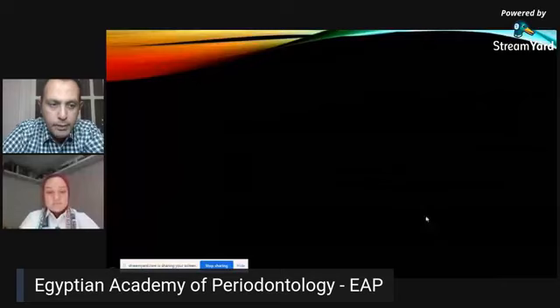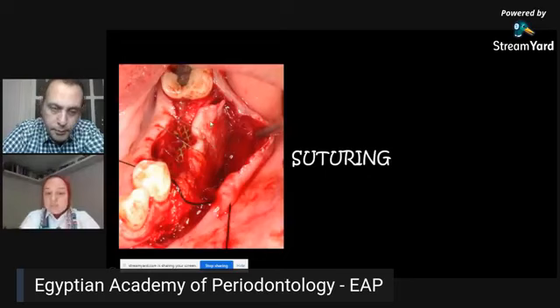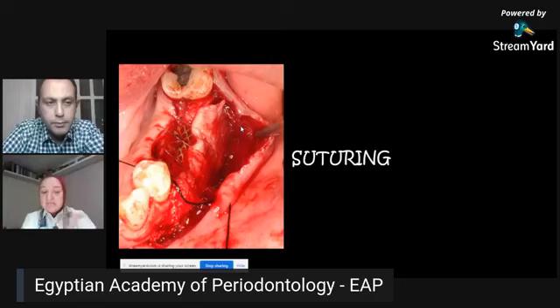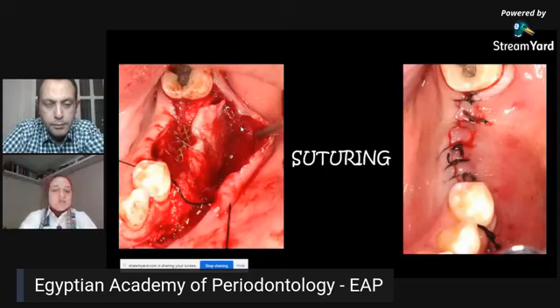Okay. So, as we said, we apply the titanium mesh and the graft material, and then we start suturing the inner layer alone. As you can see, the inner layer is still tough and tight because it's not separated from the periosteum. And this periosteum is the reason why you cannot achieve primary closure with this extension. Imagine if this flap was all one piece. You will never achieve primary closure without doing something with the periosteum. So instead of doing the normal scoring or the fenestration of the periosteum that we do with the periosteal releasing incision, we separated the inner tough layer from the outer mucosal layer that is now free, and that will actually attain the primary closure and will be sutured separately as an outer layer using silk or whatever suture material you want.